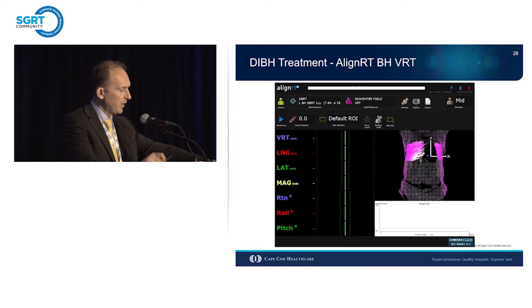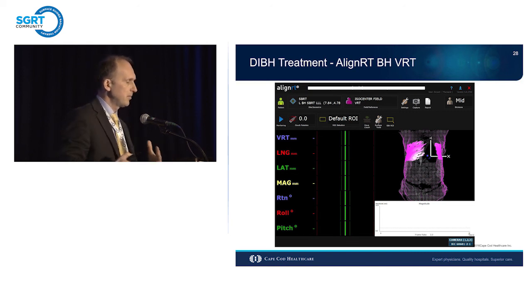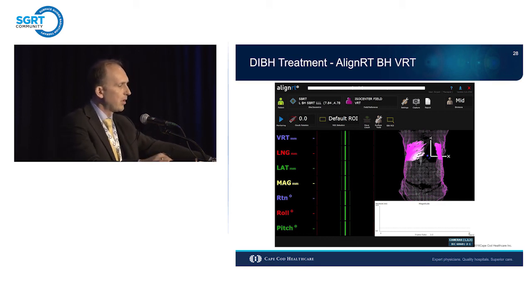What else can I say about this? Men who have very few details up in the chest, if you wish, are usually harder to monitor than women who have more topography, and you get more feedback, different surface areas.